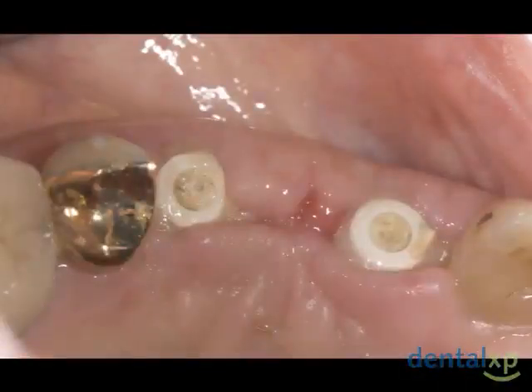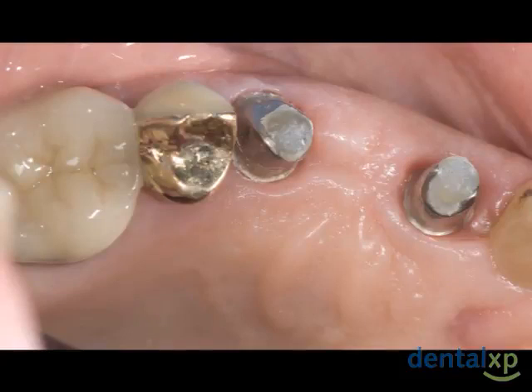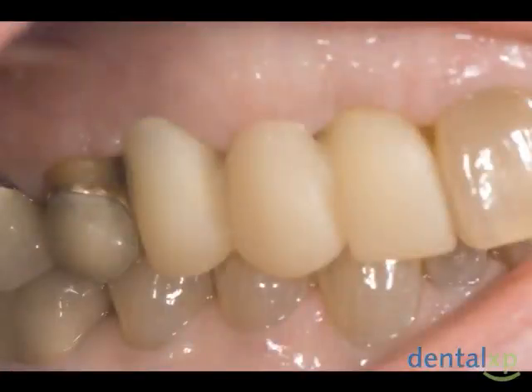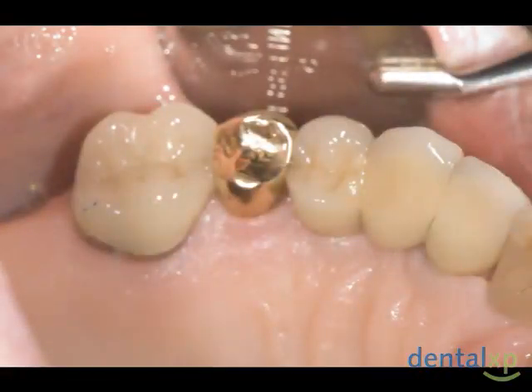X-ray view of the modified healing abutments in place. The modified healing abutments now contour the tissue to create proper emergence profile. Custom abutments for the final restoration are fabricated and placed. A provisional restoration is placed on the custom abutments to ensure proper tissue contour. After additional healing time, the final restoration is placed.